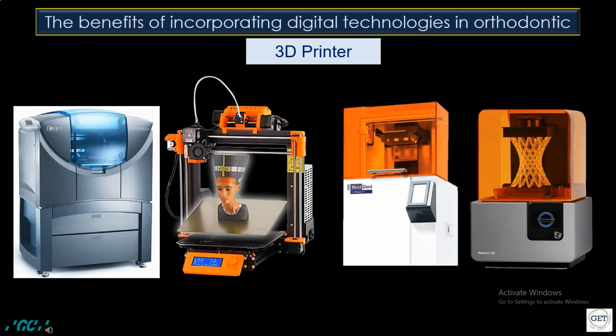3D printers were at first introduced in the dental profession in dental laboratories due to their high cost. Today, with the development of different 3D printing technologies, the printers have become more and more used in dental offices. The use in the orthodontic office offers many advantages for the orthodontist.